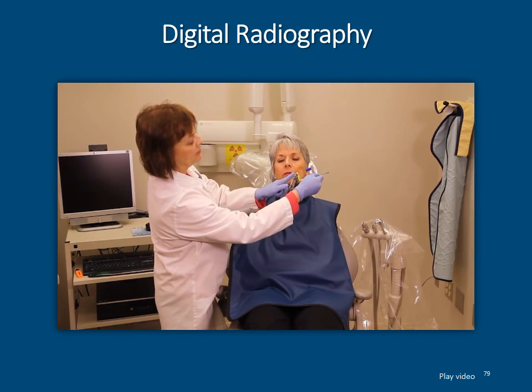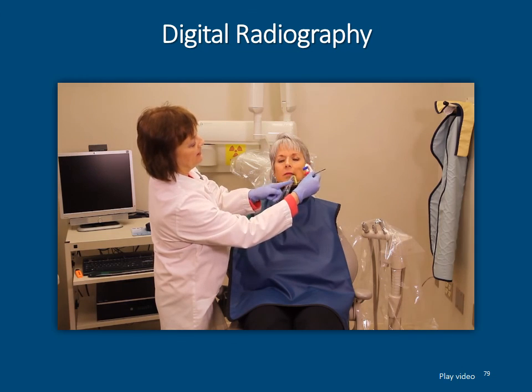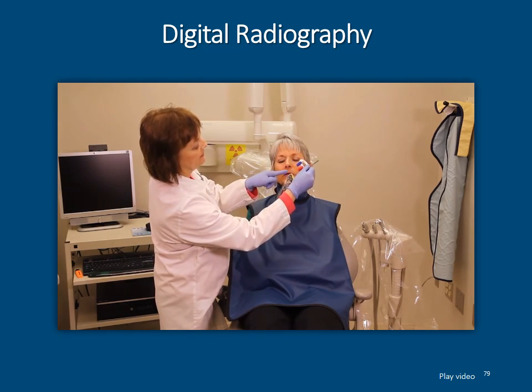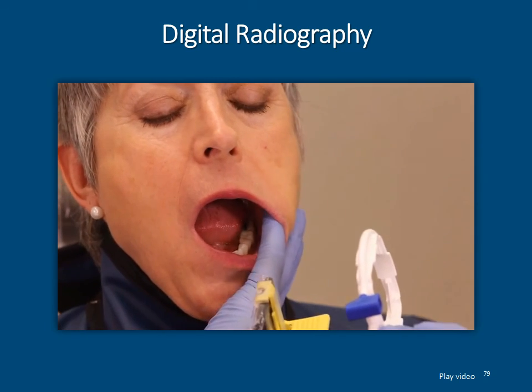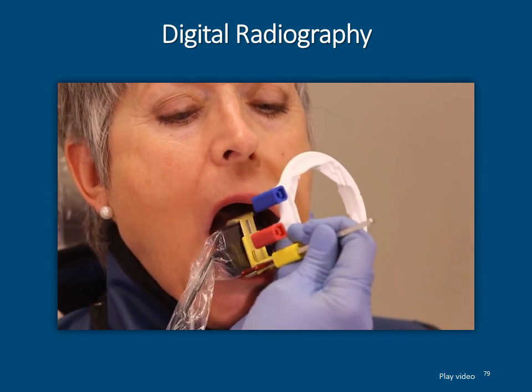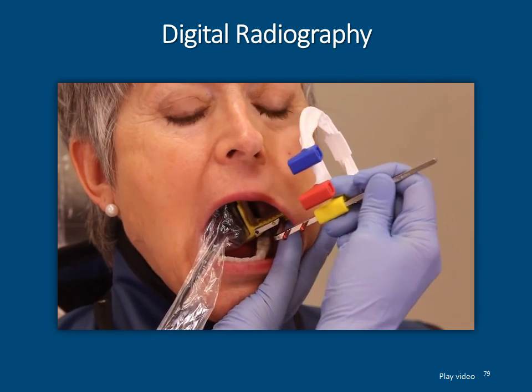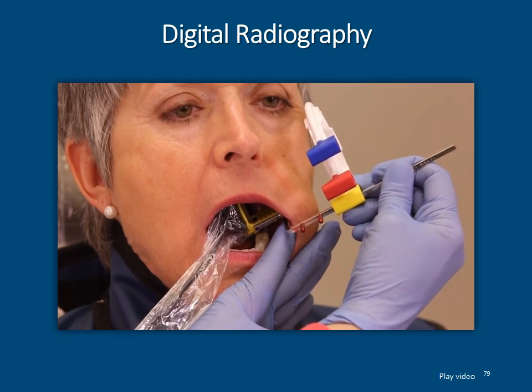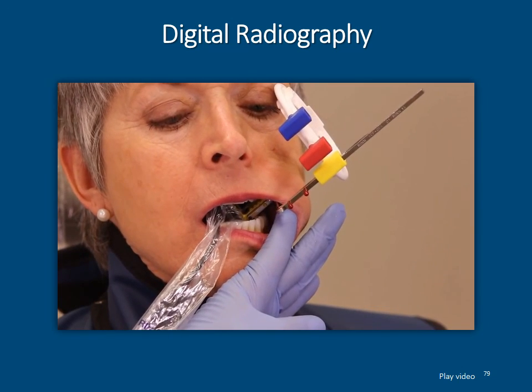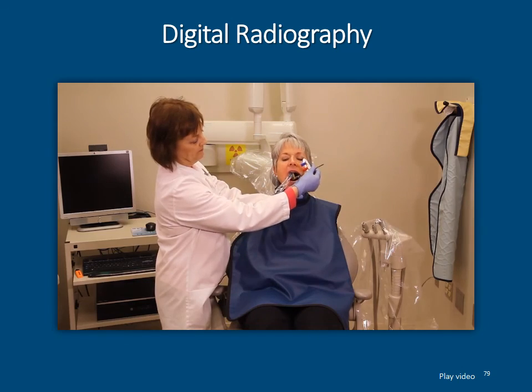So when you slide it in, make sure you're sliding it in so that this instrument looks like a little V here. Retract the cheek with your forefinger. Really make a lot of room for the sensor because it is a little bulky. Stretch the cheek out so you are putting that bite block way back into the pocket. Have her gently close, and you're ready for your molar. Open.